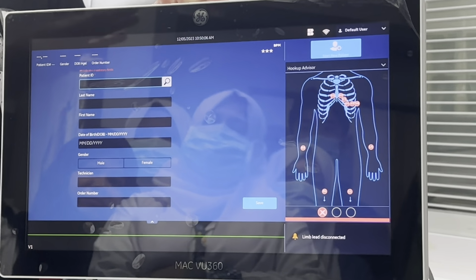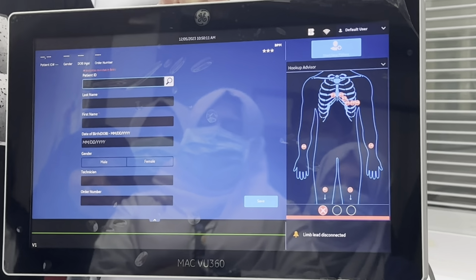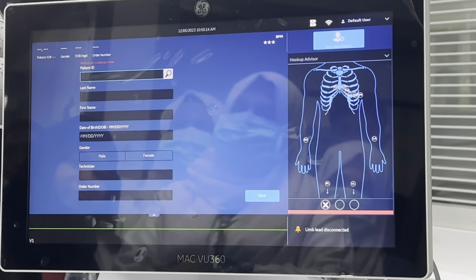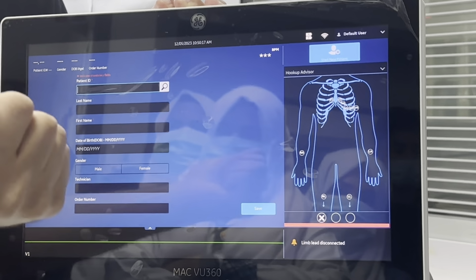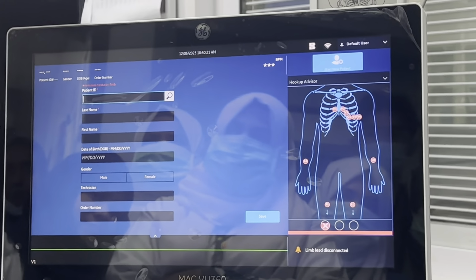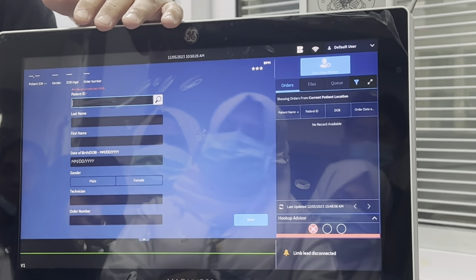So if your physician is looking for an ECG, please ask him to place an order. If you have the privilege, just place an order before you go to your patient. So we will retrieve that order with all patient information to the machine. We will attach one report to it and send it back. In this way, it will show up under the patient's profile directly.